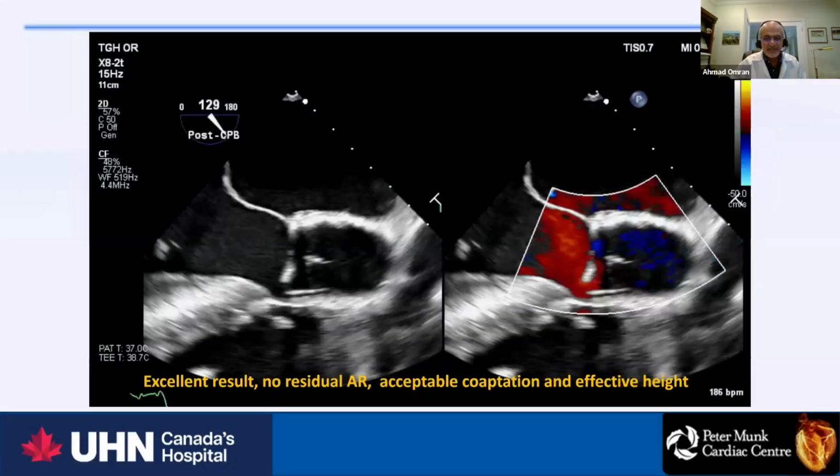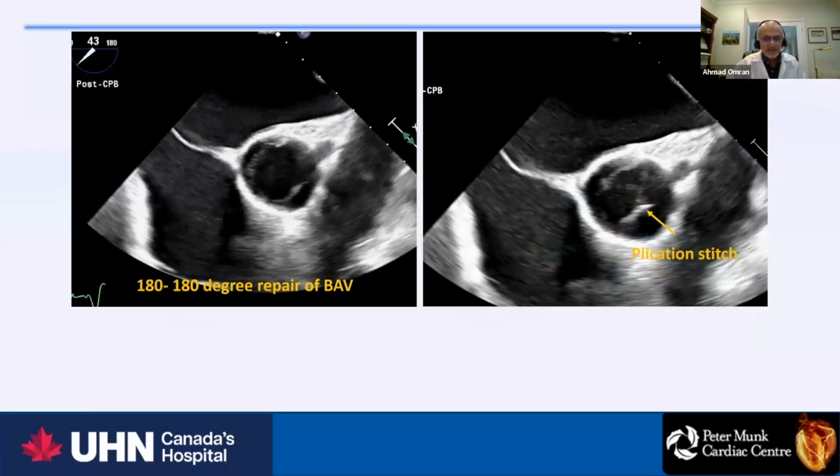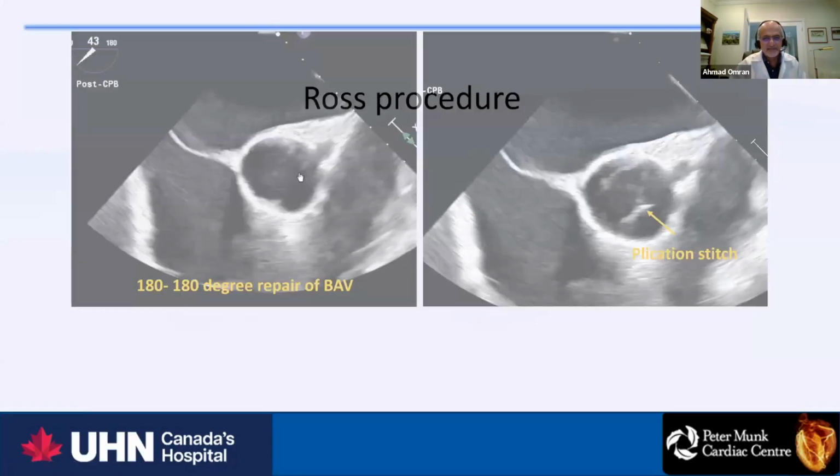So that's the post-op again. See, the valve was preserved and there is no AI. The valve became symmetric now. So it's a true bicuspid and it's very good.